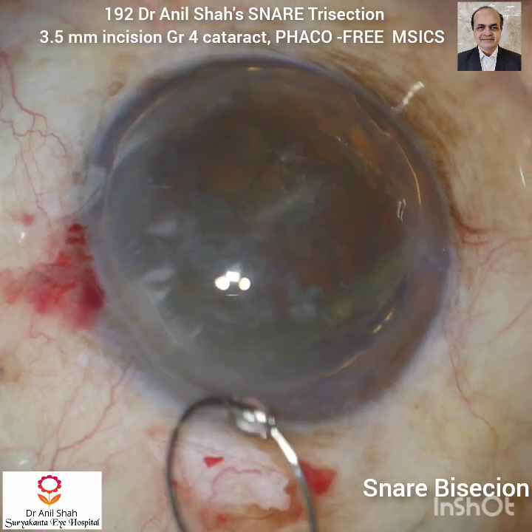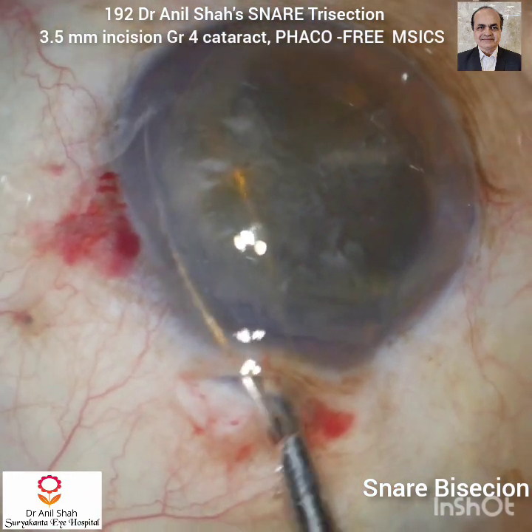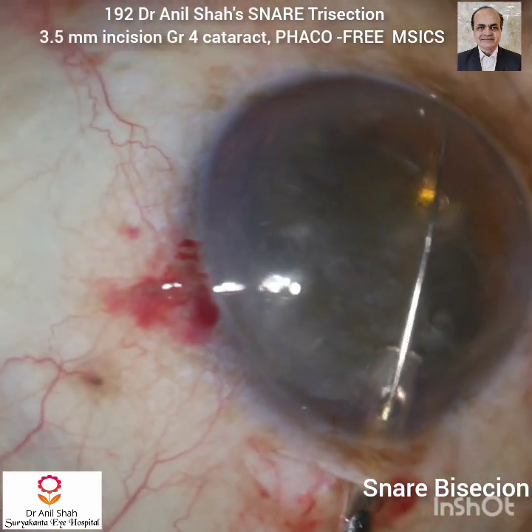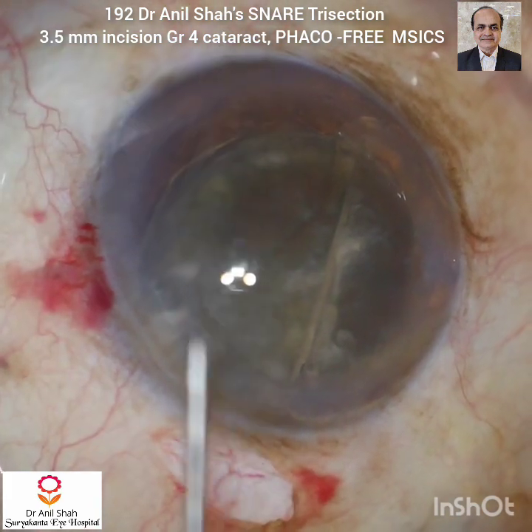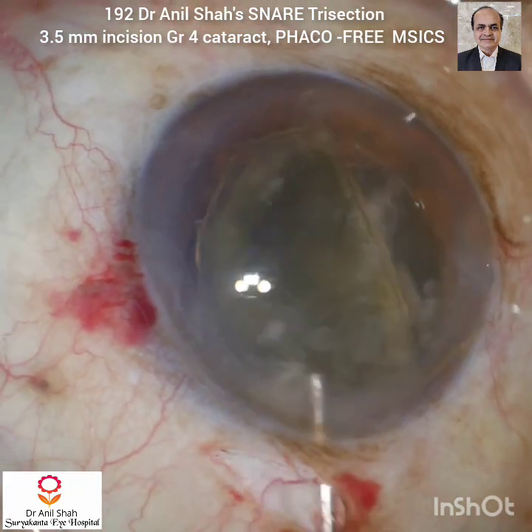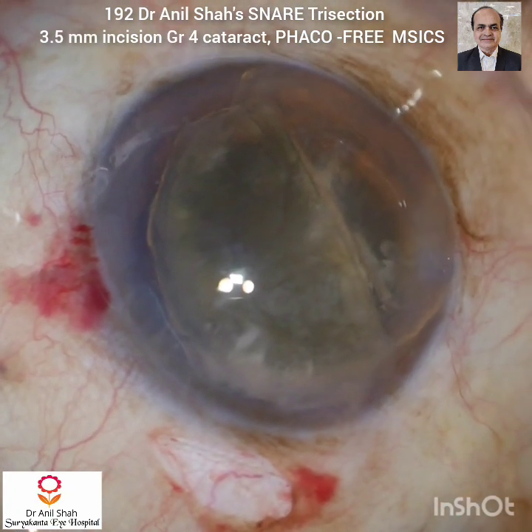Now I will use the snare to do bisection. Make the loop smaller than the size of the nucleus, pass it through the tunnel obliquely, then slowly enlarge the size of the loop and divide the nucleus just by pulling the handle. As this loop becomes smaller it is away from the endothelium and away from the posterior capsule, so it does not cause any damage to the endothelium and posterior capsule. Sodium hyaluronate gives good protection to both.